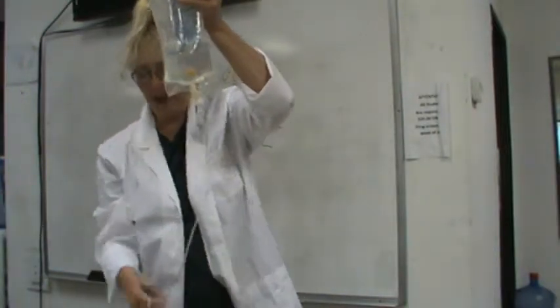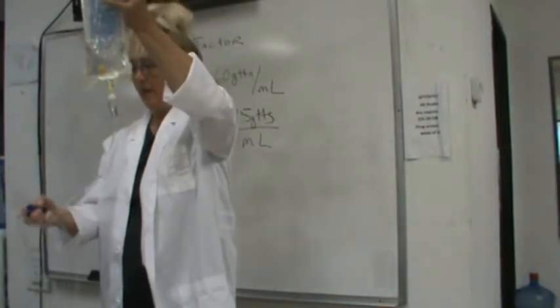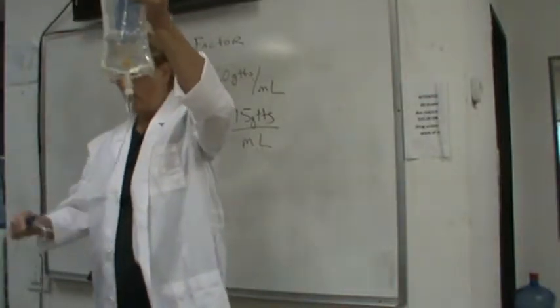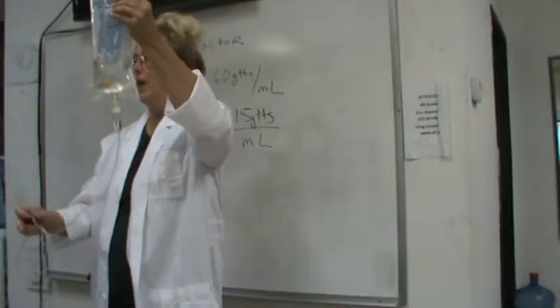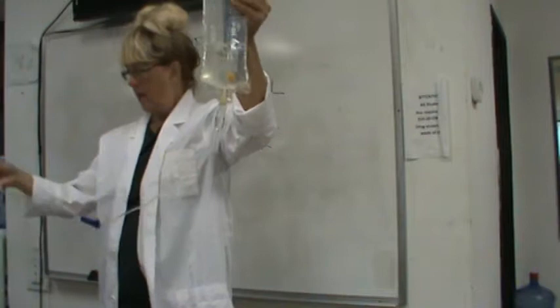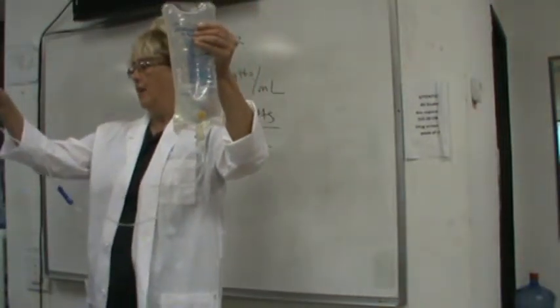Lock it now. Everybody lock it, because we're going to leak all over the place. Now lock it. Guess what? Nobody should have any bubbles in their IV. Nobody.